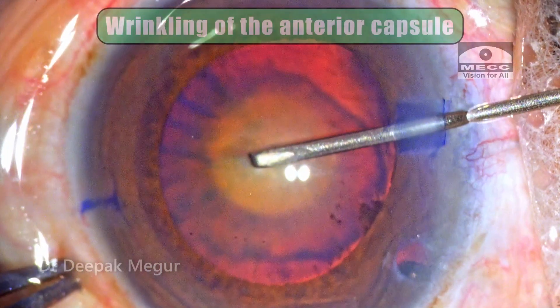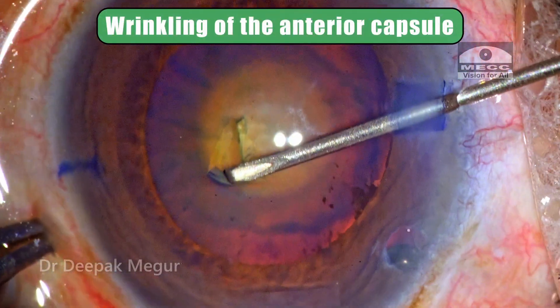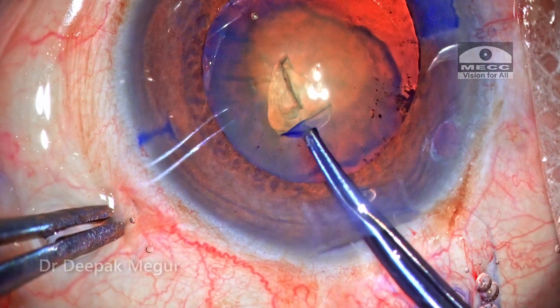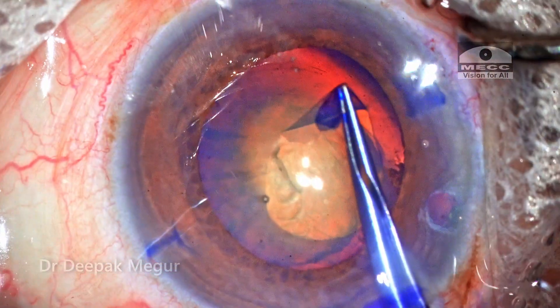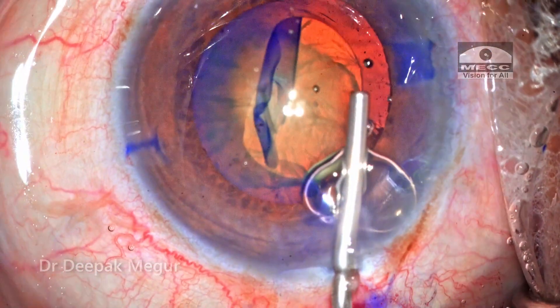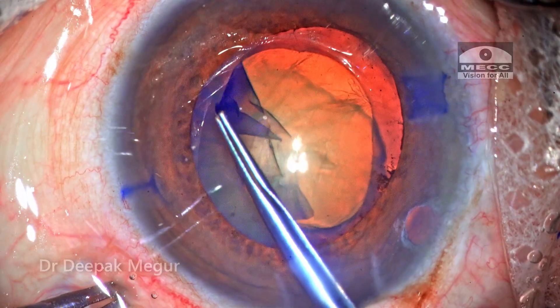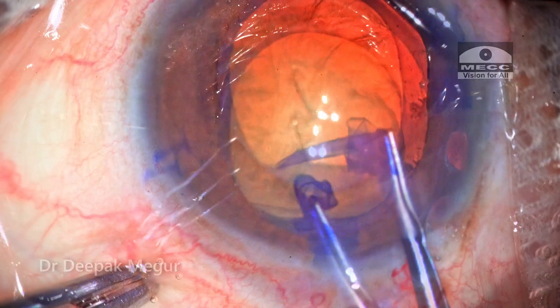As soon as I puncture the anterior capsule, I can see the wrinkling of the anterior capsule, suggesting that the zonular health might not be very great. I quickly switch over to my forceps, which is my preferred instrument to perform rhexis in eyes with suspected zonular weakness. I'm aiming for a rhexis of about 4.5 to 5mm, and a decent-sized, well-centered rhexis is created.